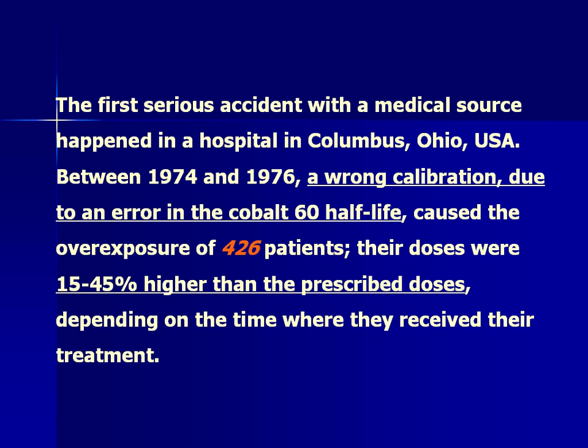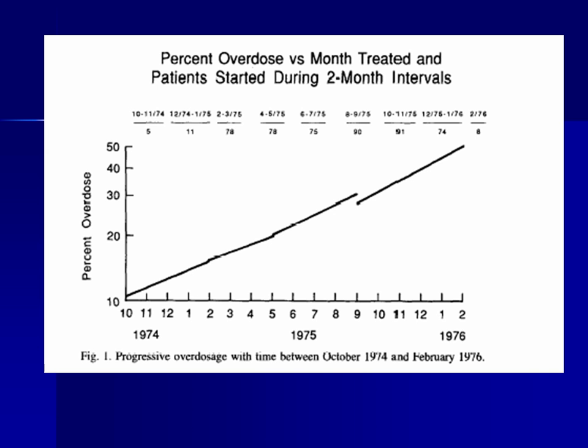It must not have been going on to check how they were doing this by hand, this automatic decay, were they doing it properly? So in other words, you kind of get into this complacent mode where you're just assuming you're doing everything right, and what's so hard about calibrating a cobalt machine? It should be relatively easy.